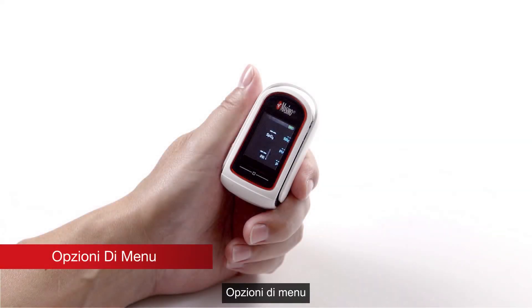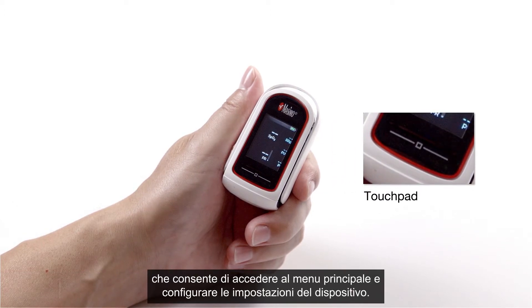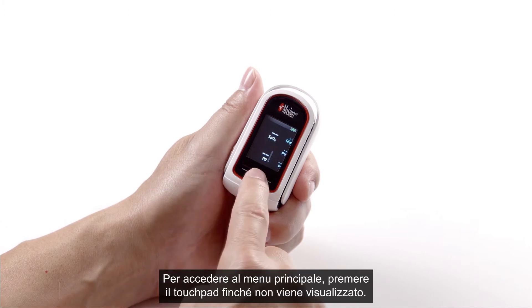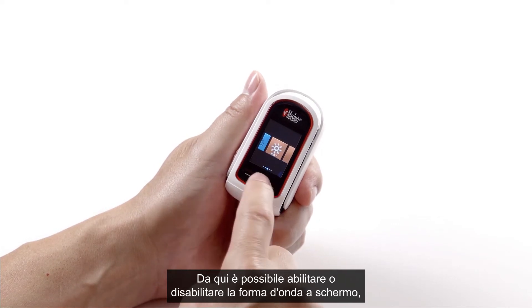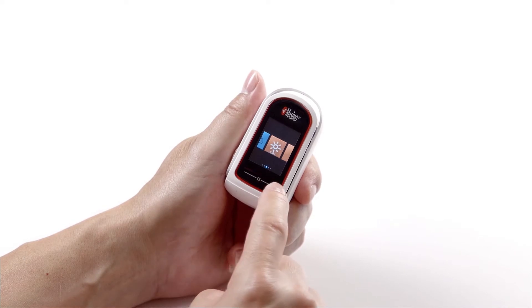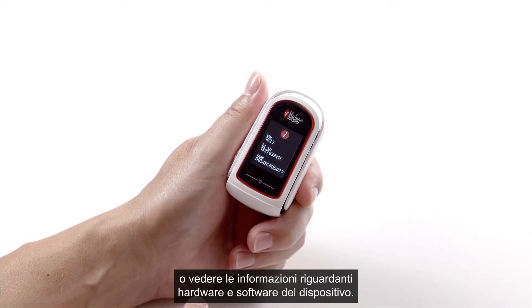Menu options. The MightySat RX features a touch pad located below the display screen, allowing users to access the main menu and configure device settings. Press and hold the touch pad until the menu appears. From this menu, the user can enable or disable the waveform on the screen, increase or decrease the brightness, activate or deactivate Bluetooth, or find hardware and software information about the device.